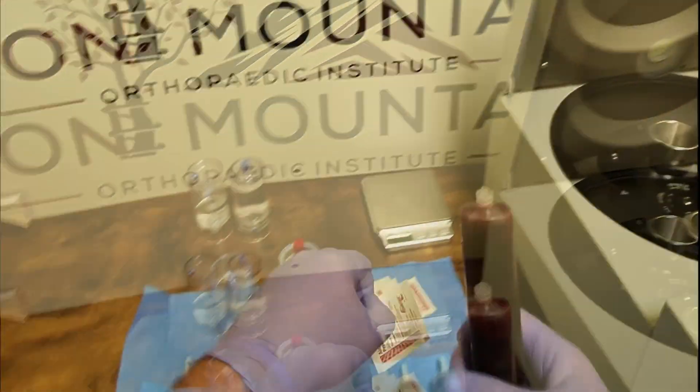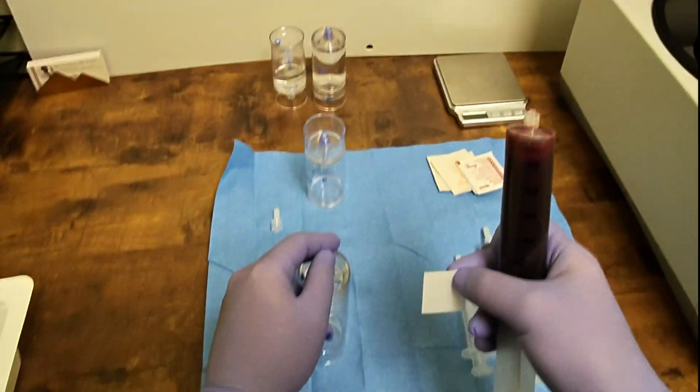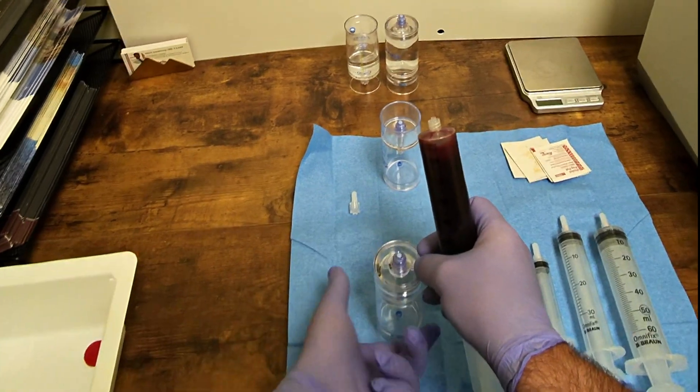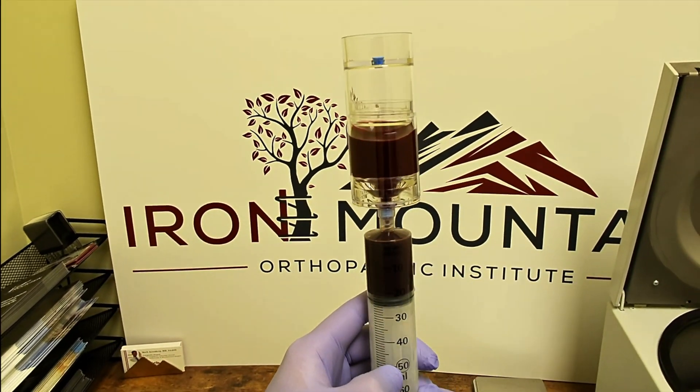The anticoagulated blood is then loaded into the separator device. This video is accelerated in speed, but it is important to transfer the blood slowly to minimize lysing red blood cells, which is detrimental to the final product.